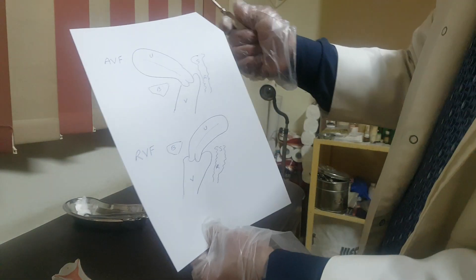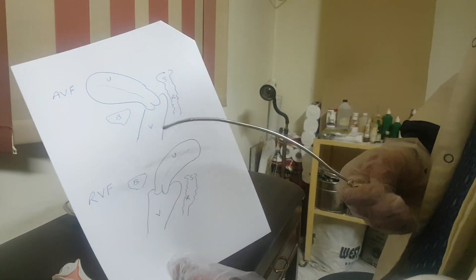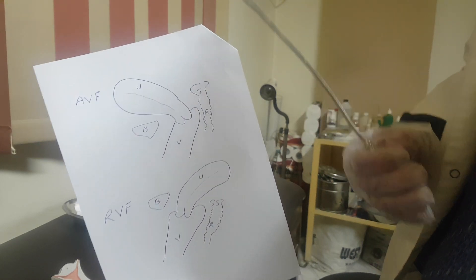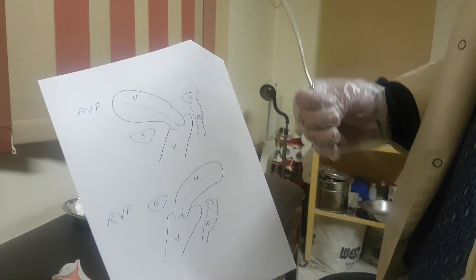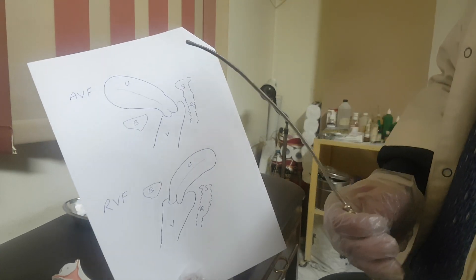The next indication for uterine sounding is to know AVF uterus from RVF uterus — the position of the uterus. This is very important before many procedures like IUD insertion, for example. You want to know the direction and the length of the uterus before IUD insertion, so you are in need of uterine sounding.